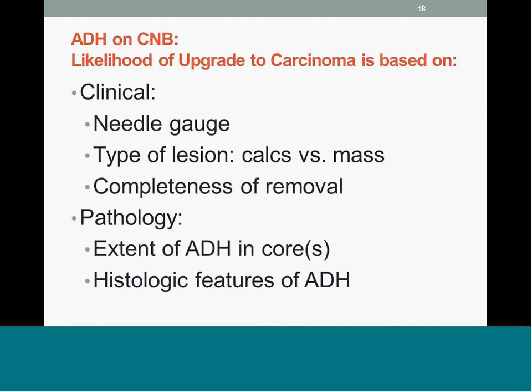On the pathology side, there are different ways of quantifying the degree of ADH. We'll talk about this in a moment. And the histologic features of the ADH can be important. For example, if one sees a hint of some micropapillary pattern, or perhaps a suggestion of some sort of comedo-type necrosis, then those are features that are more likely to indicate that there will be an upgrade to carcinoma.